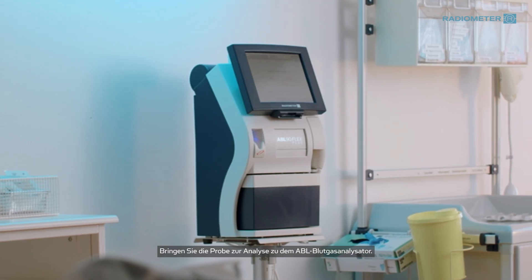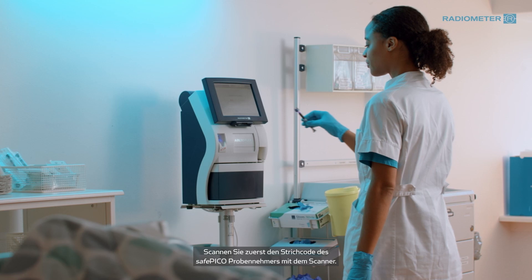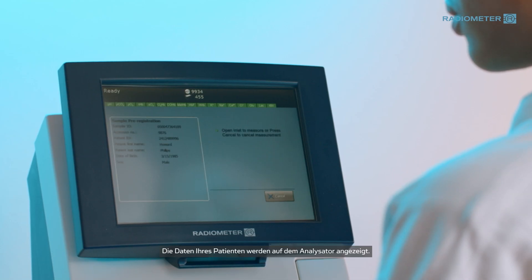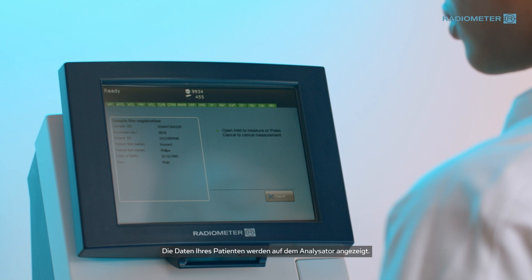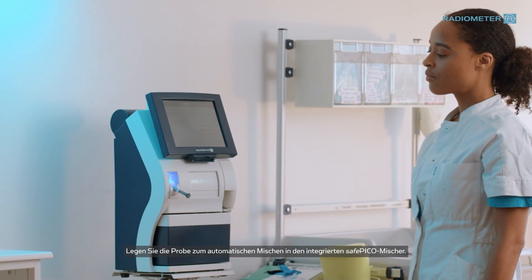Take the sample to the ABL Blood Gas Analyzer for analysis. Begin by scanning the barcode on the SafePico syringe using the scanner. Your patient's data will be shown on the analyzer.